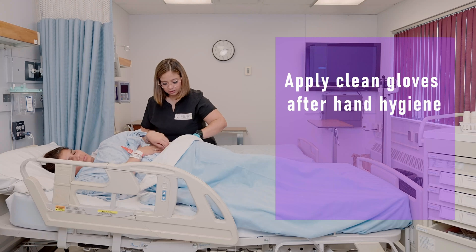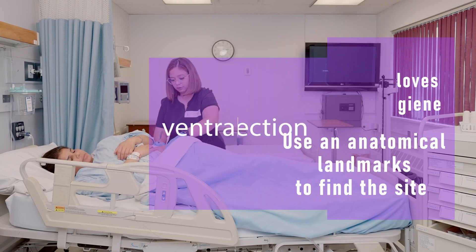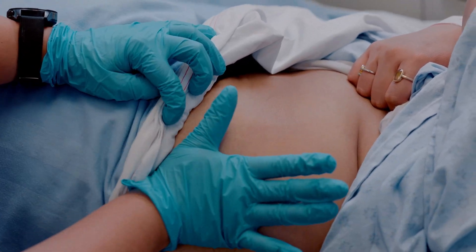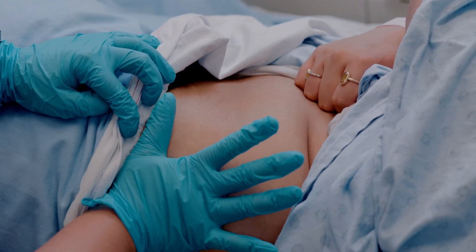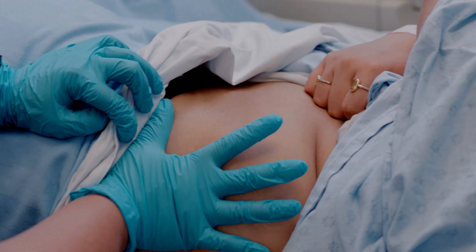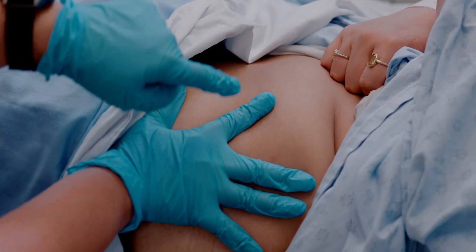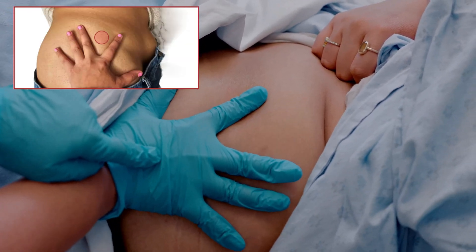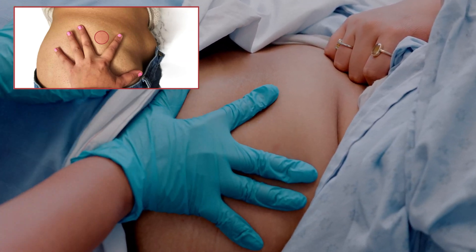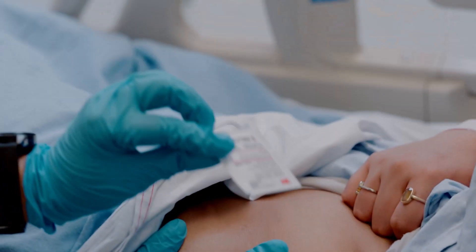Apply clean gloves after hand hygiene and use anatomical landmarks to find the site. For ventrogluteal injection, place the heel of your hand over the greater trochanter of the patient's hip with the wrist almost perpendicular to the femur. Point the thumb towards the patient's groin, point the index finger to the anterior superior iliac spine, and extend the middle finger back along the iliac crest towards the buttock. The index finger, middle finger, and iliac crest form a V-shaped triangle — this is the injection site for ventrogluteal injection.